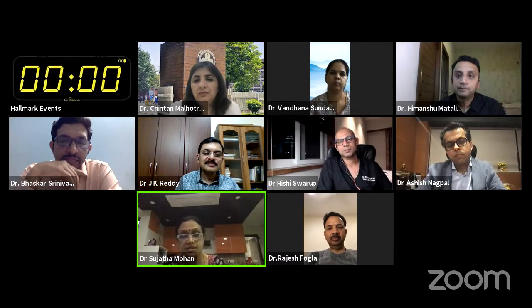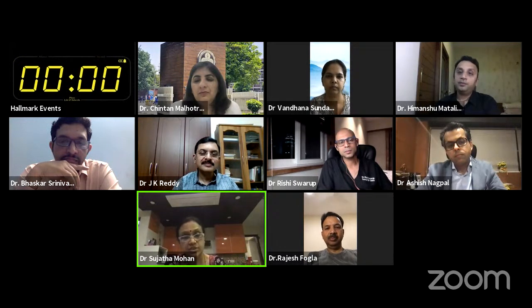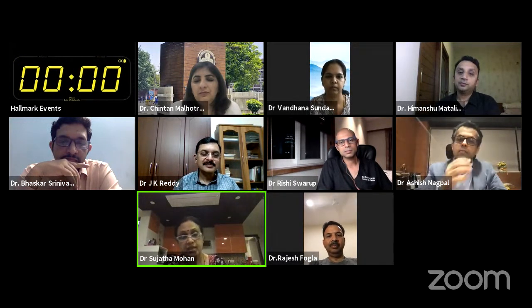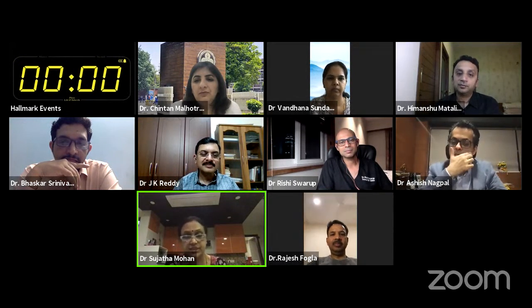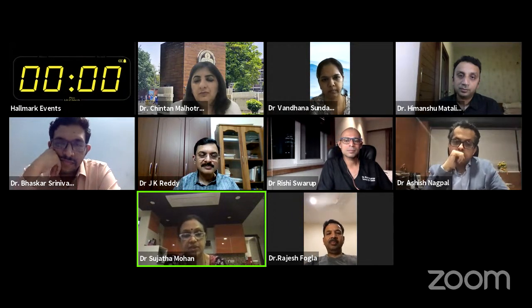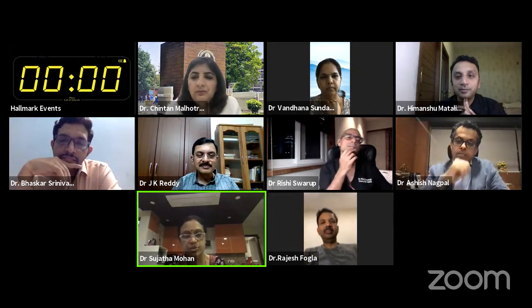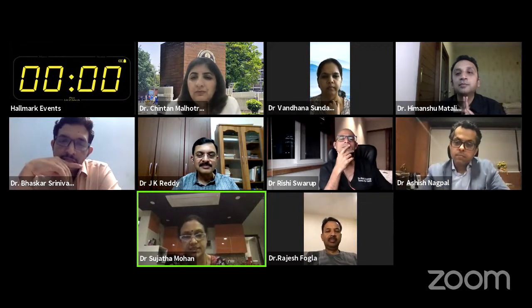Dr. Babu Rajendran started excimer lasers, and in those days there was no eye tracking. And he has treated 12 diopters, 20 diopters and all that. So we do see quite a lot of patients in Chennai coming for cataract surgery with no complaints. Believe me, they're so happy. So why would I touch them unless I need to do a premium lens, and I'm not able to do the calculation because the decentration is quite significant.